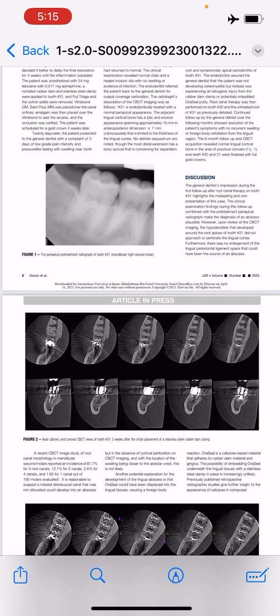Periapical radiographs were obtained and interpreted as having mesial and distal root lucencies. Tooth number 31 was diagnosed as previously treated with chronic periapical abscess, and the patient opted for incision and drainage with endodontic consultation. Antibiotic was then prescribed. CBCT imaging was ordered, and the patient was scheduled for re-evaluation with the endodontist.